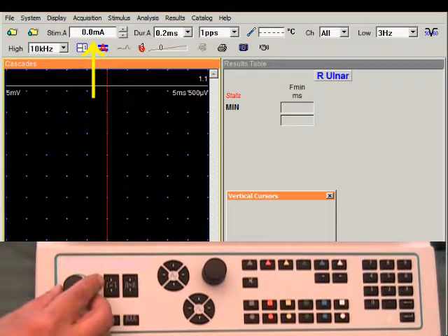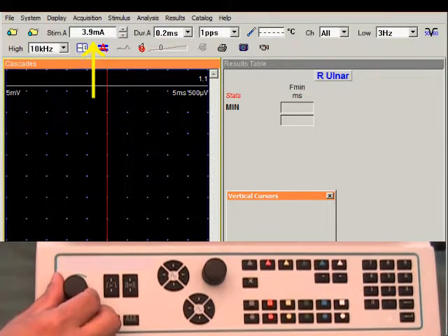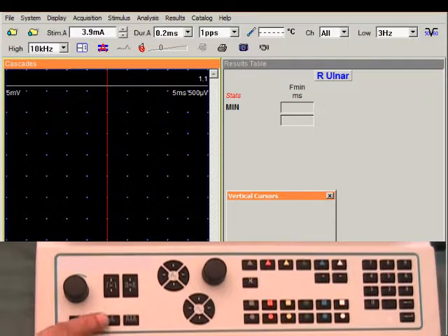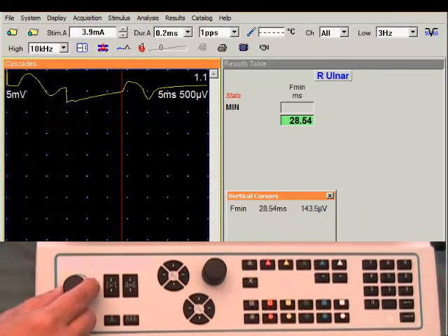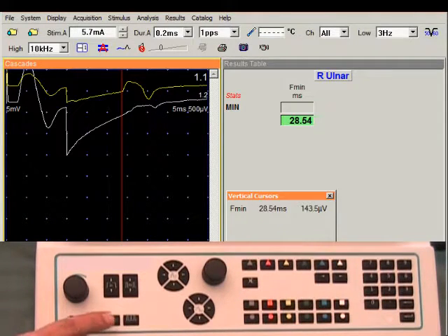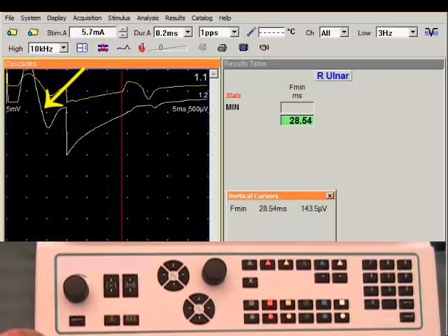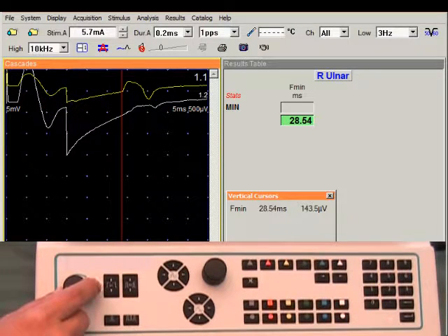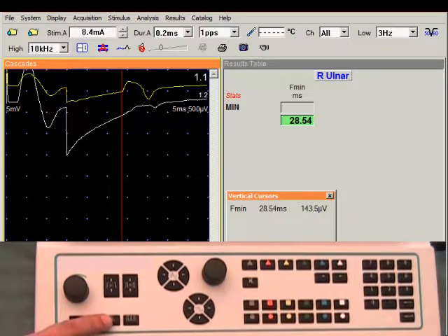We're going to turn up our intensity just slightly and use the stimulate key. We're going to verify that we're at supramaximal by turning up just a little bit more. The compound motor action potential got much larger, so we're going to turn it up a little bit more to make sure we are supramaximal.